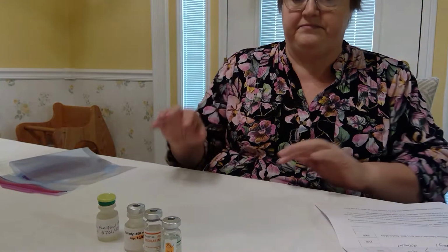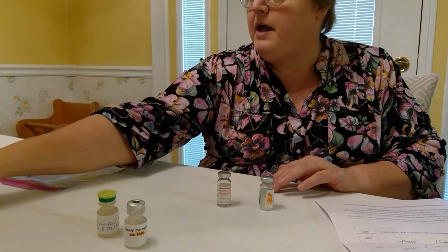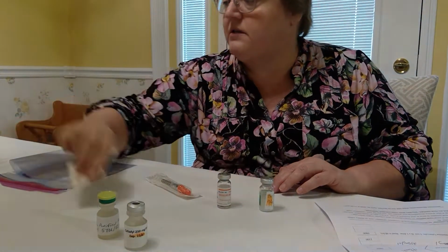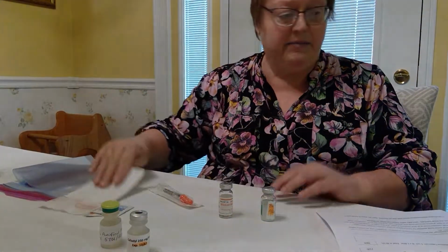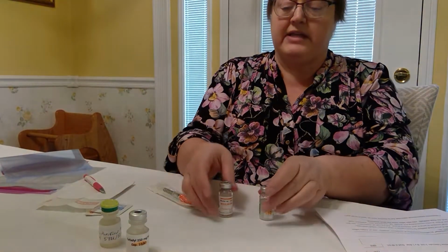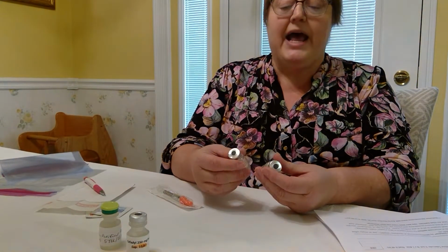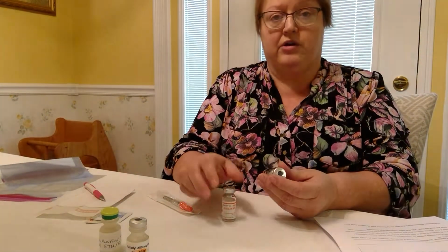The first thing I'm going to do is get my insulin set up. I'm going to have my NPH and my R. I'm going to need an insulin syringe, alcohol swabs, and a label and a pen. To begin my insulin, since these are both insulins that can be mixed together to only create one shot for the patient, I'm going to mix them together using the method that is outlined in your book.